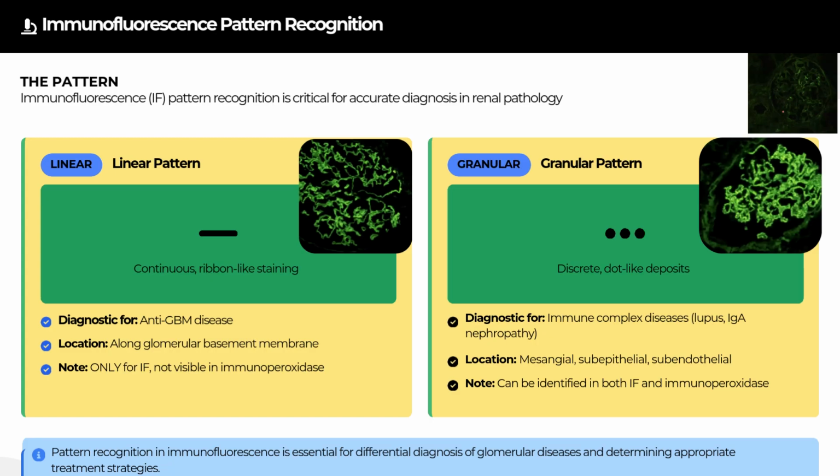Next, we assess the quality of the staining, including the intensity, pattern, and specific structure stained, such as mesangium or capillary walls. For example, in a negative glomerular stain, you wouldn't see significant staining like here, but the glomerulus and surrounding tissue will still be visible. Occasionally, the area of collagen in the mesangium may show autofluorescence, which can be misleading. However, at higher magnification it becomes clear there are no true granular deposits, but rather normal tissue artifacts.